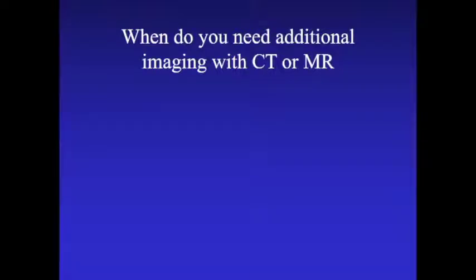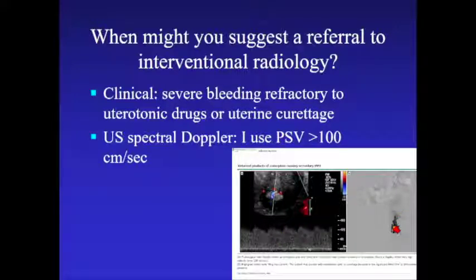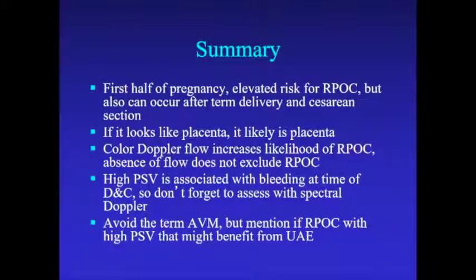When do you need CT or MRI? Basically never. I am showing one angiography case where we had high peak systolic velocity — you can see an early draining vein. These are the patients who might benefit from embolization prior to treatment. In summary: elevated risk for retained products in the first half of pregnancy, but it can also occur after term delivery and C-section. If it looks like placenta, it probably is. Color Doppler flow increases the likelihood of retained products, but absence of flow does not exclude the diagnosis. High peak systolic velocity is associated with bleeding at the time of D&C — so assess with spectral Doppler. Avoid the term AVM, but mention retained products with high peak systolic velocity that might benefit from uterine artery embolization.